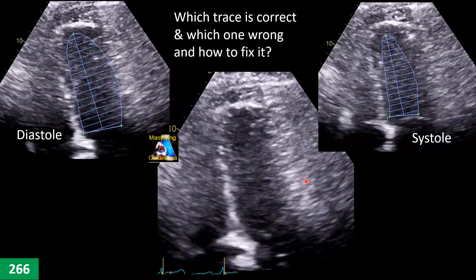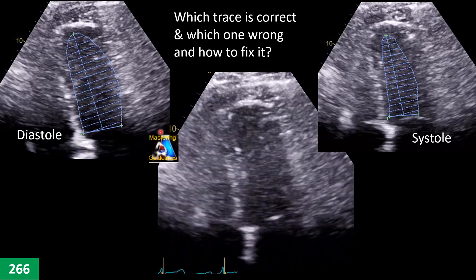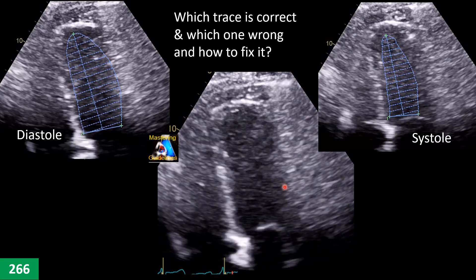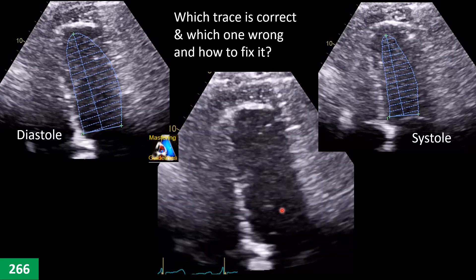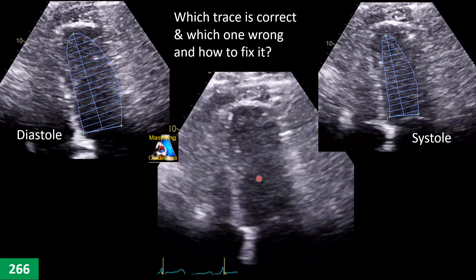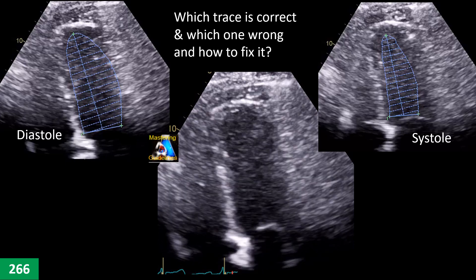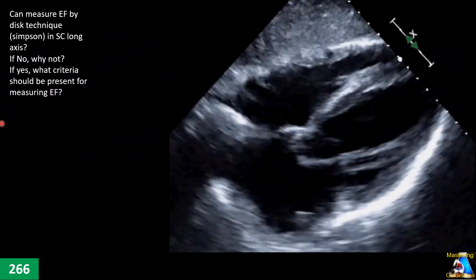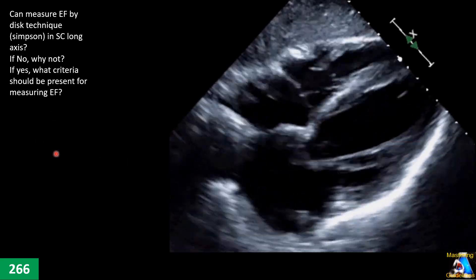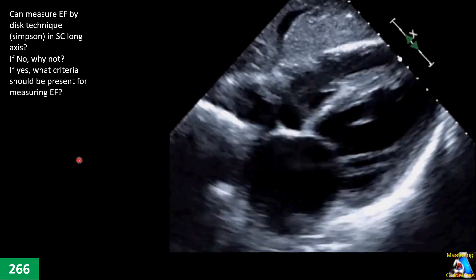Here we have another case with a not-good window for the chamber. The tracing and ejection fraction measurement show diastole and systole. Do you generally perform tracing and ejection fraction on this type of image quality and border? If you do, is this tracing correct? And if you don't have access to contrast, what options do you have to better define the border? If we don't have an apical window, can we do ejection fraction by Simpson's technique in a subcostal four-chamber view? If no, why not? If yes, what criteria must the image meet for an accurate measurement?